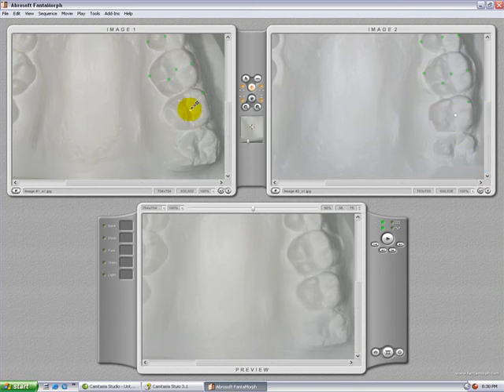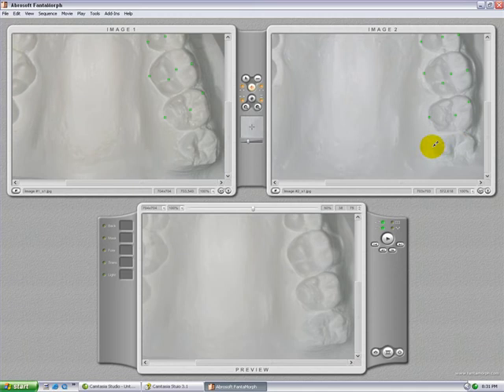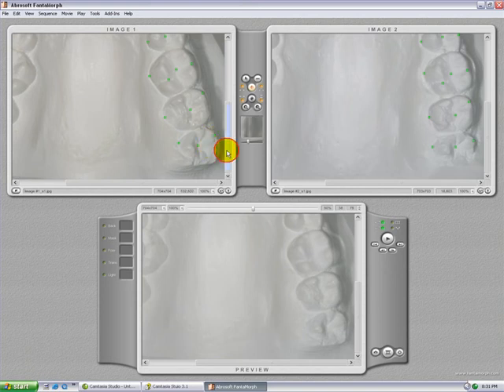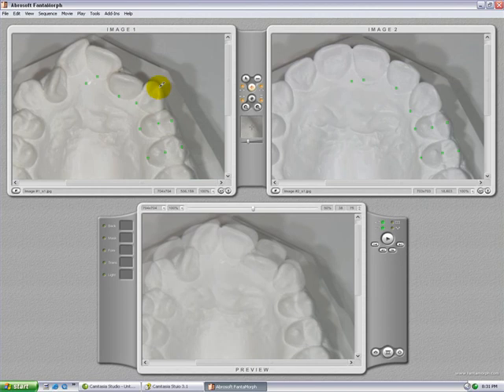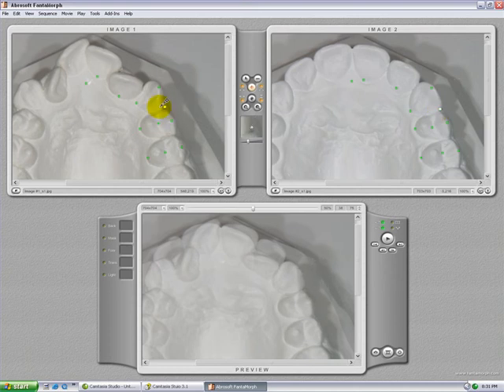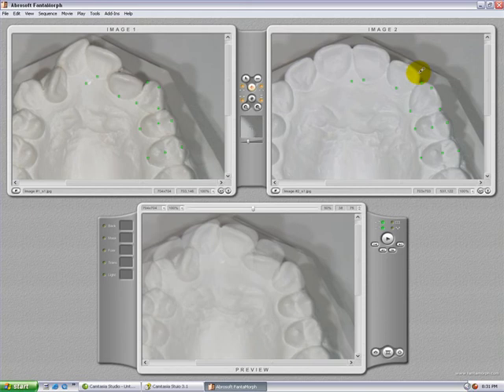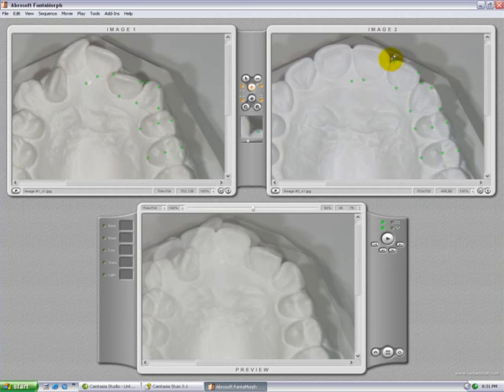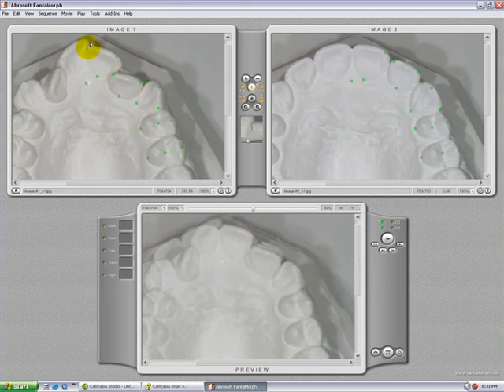When you place a dot in one image, you have to reposition the dot on the other image at the same landmark. If it's in the middle of a cusp, place the dot on the other image also in the middle of the cusp. For rotated teeth, make sure that the mesial and distal landmarks are properly positioned. It would be very good to go to the other image to place all the landmarks on all separate teeth.